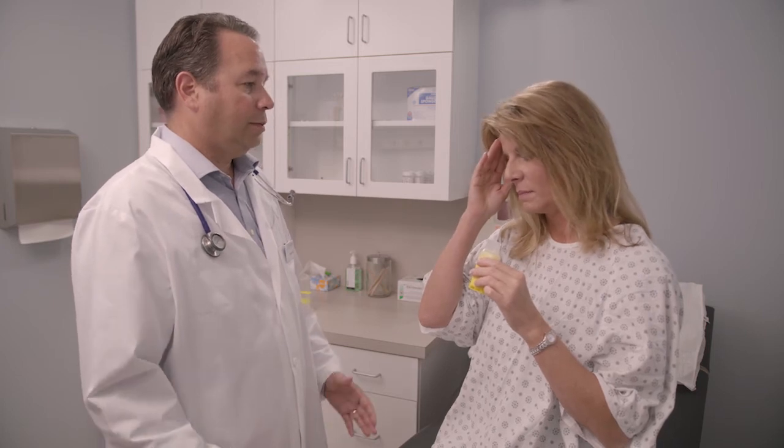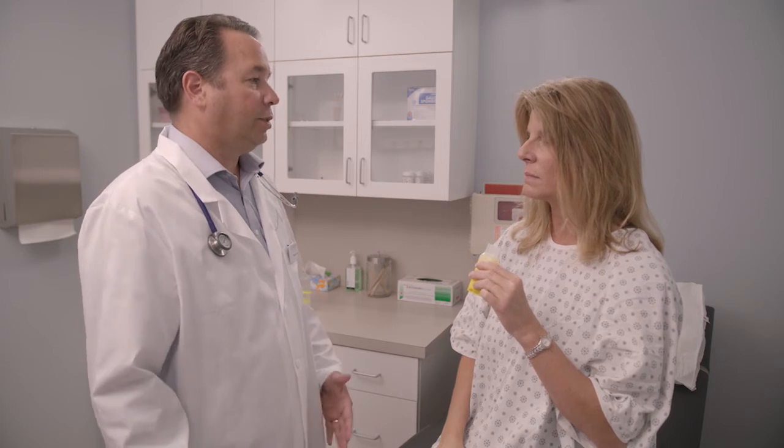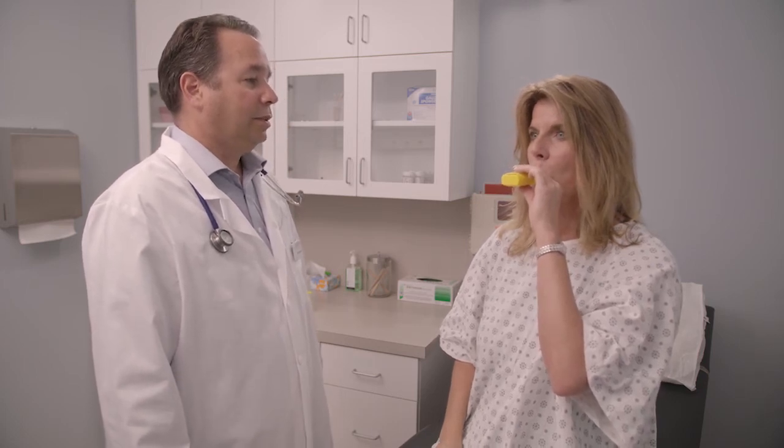If you feel dizzy or lightheaded while using the Pocket PEP, take the mouthpiece out of your mouth and breathe normally, then begin using it again. If you still feel dizzy or if you have any other problems while using the Pocket PEP, stop treatment and talk to your healthcare practitioner.